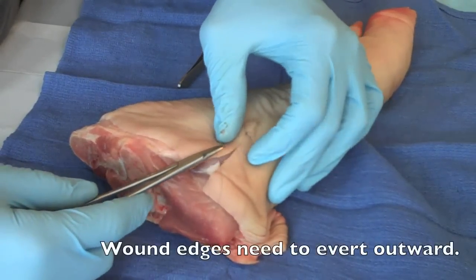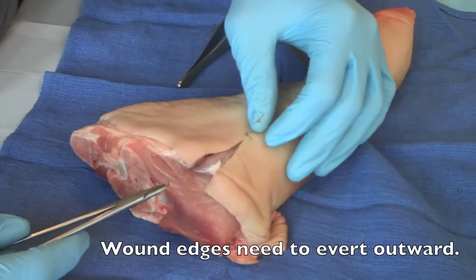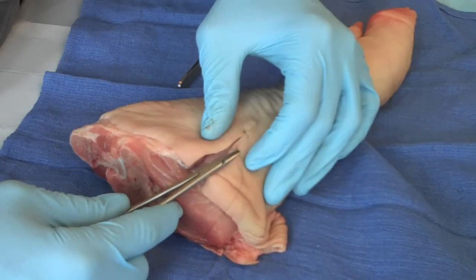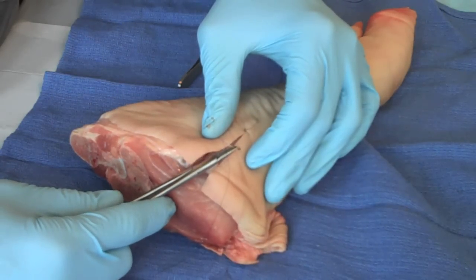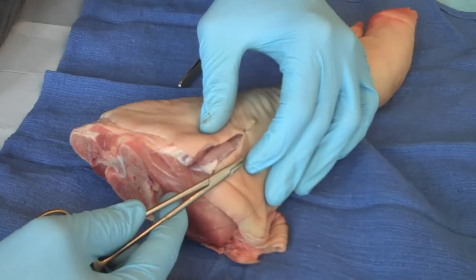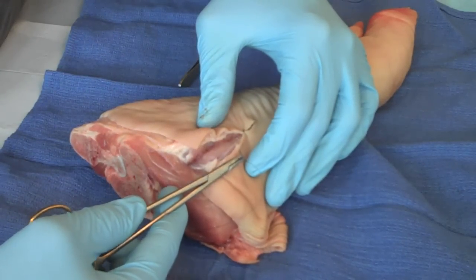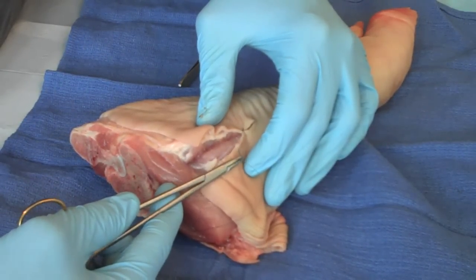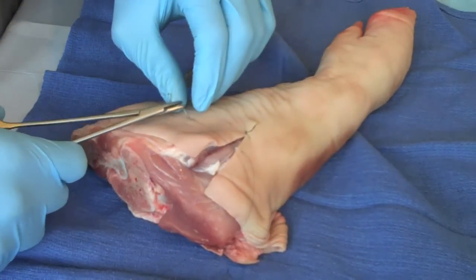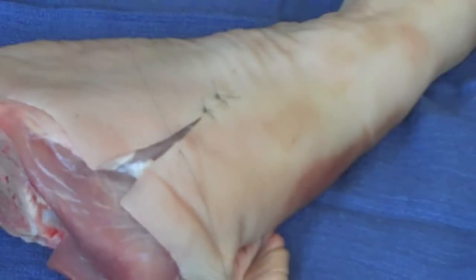We're looking for the wound edges to come up slightly, because when you pull the suture out, the wound edge will fall back down. I'm driving in with my needle straight down and sending it across, not involving the muscular tissue at all, but rather just the dermis and the layers of the skin. This is the fibrous portion of the tissue that we're getting through and pulling it through.